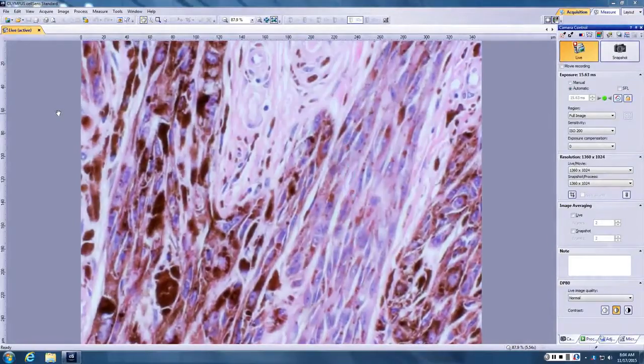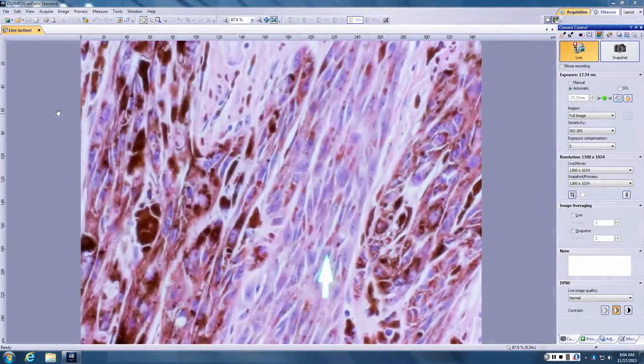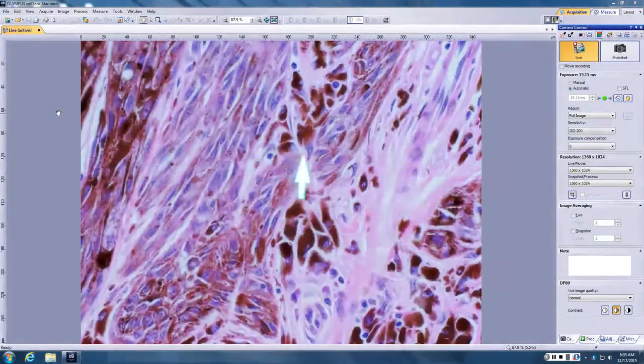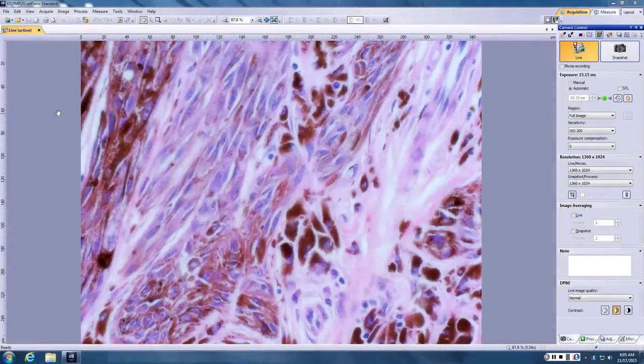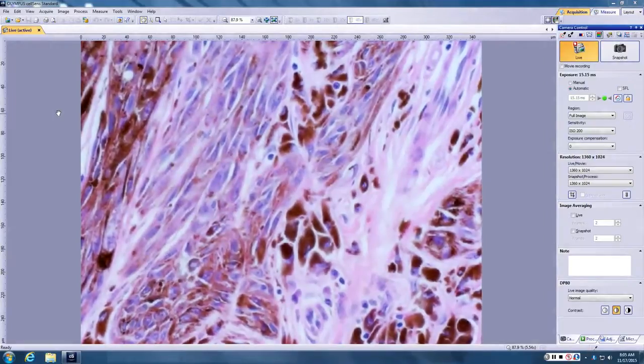Many have multiple nucleoli. And in some of them, you're starting to get this strandy chromatin pattern. So this is a really good example. Let's pull that guy to the middle. See how you've got all these tiny little chromocenters connected by strands? It's very irregular. And when you look around, a lot of the nuclei have that pattern of chromatin.